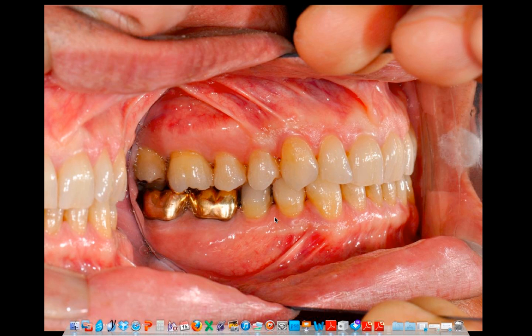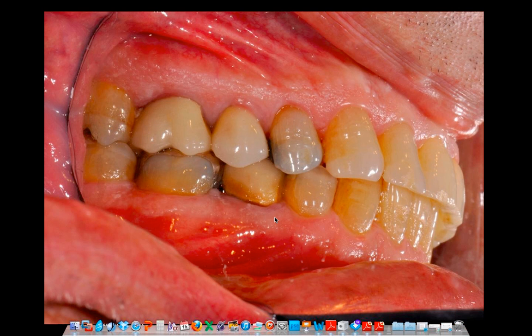Did they miss the second molar a little bit? Yeah, but I'm okay with that. It's not diagnostic necessarily. And I'd rather see a straight occlusal plane. I'd rather see a great Angle's classification than compromise all that, because you really had to stretch the mirror the wrong direction to cheat a little bit to get a second molar. Right? Here's one that was shooting up at the arch.